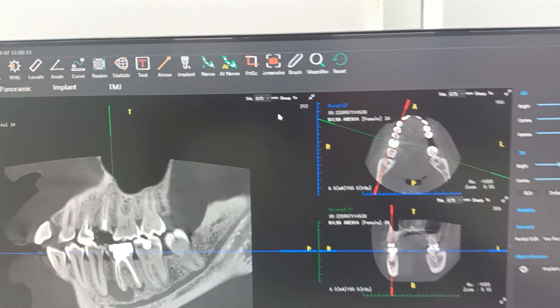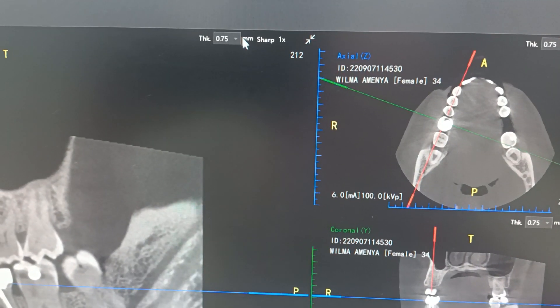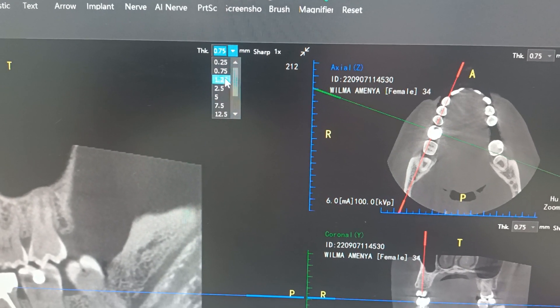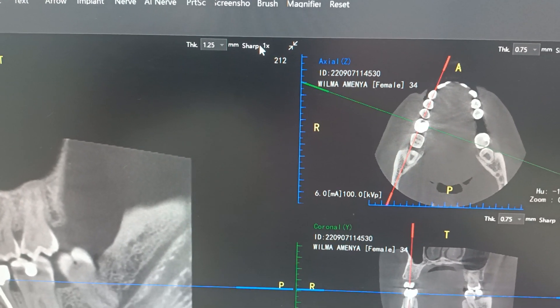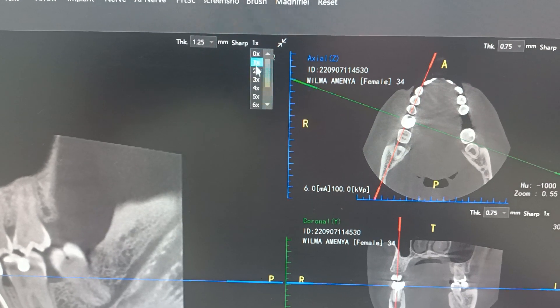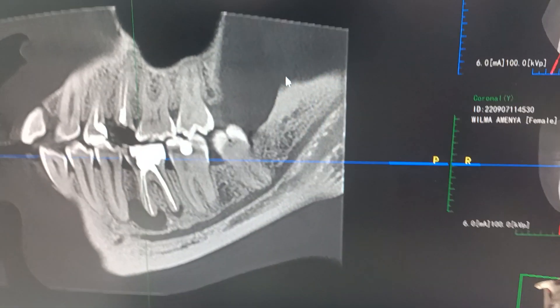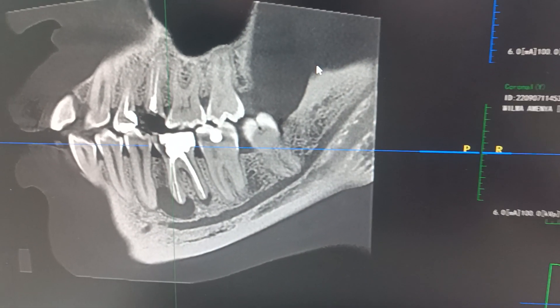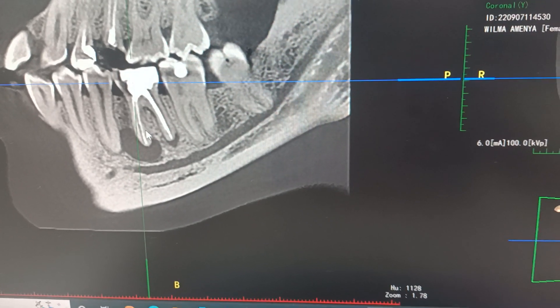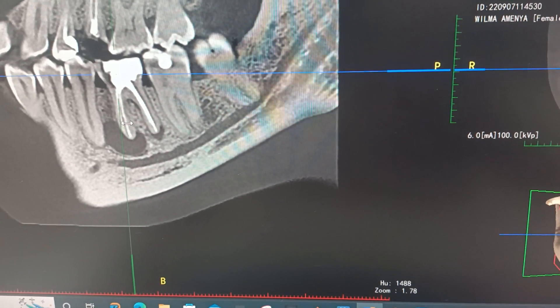You can come and click the thickness setting from 0.75, you can click 1.25. For sharpness you can put it to 5x — notice the image becomes a bit more sharp.